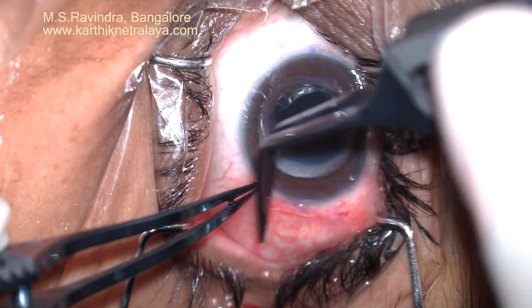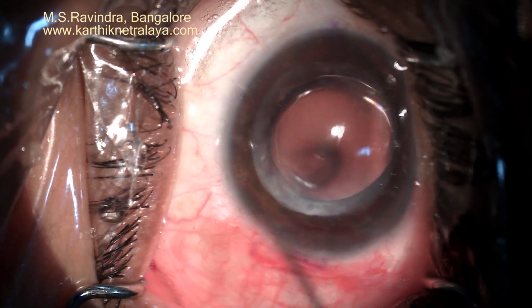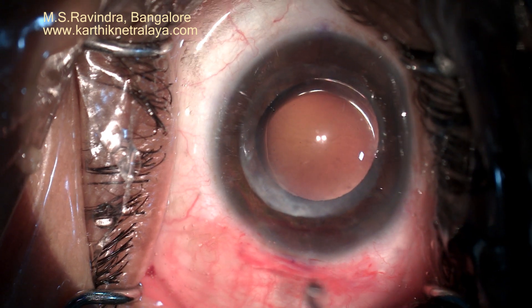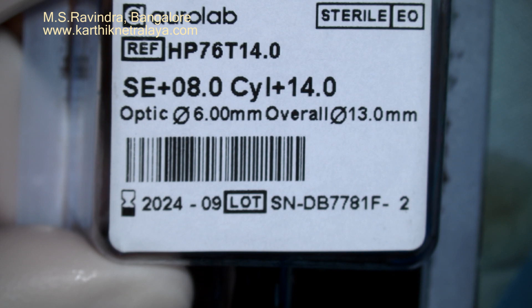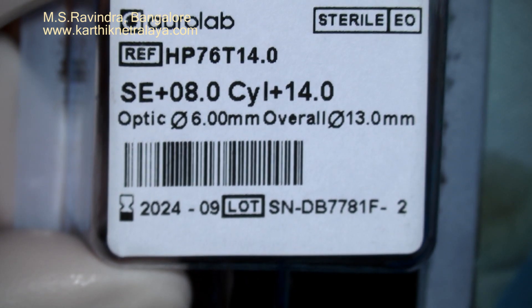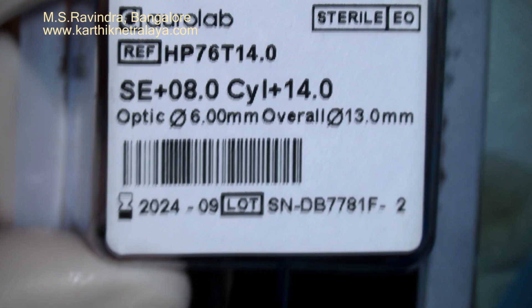I believe this is the best way to handle a patient with low endothelial count and a high cylindrical power of the cornea. On a hydrophilic platform, I have implanted up to 20 diopters of toric lens, but this is the first time I have implanted a 14-diopter hydrophobic IOL in a high cylindrical patient. Thank you.